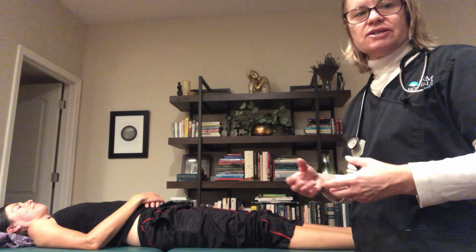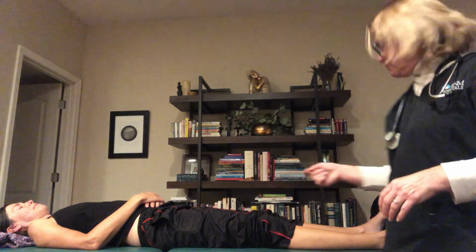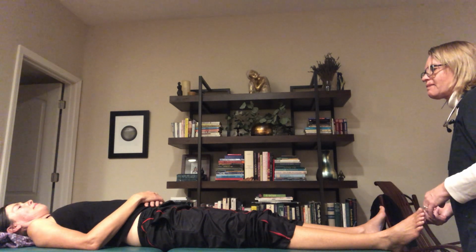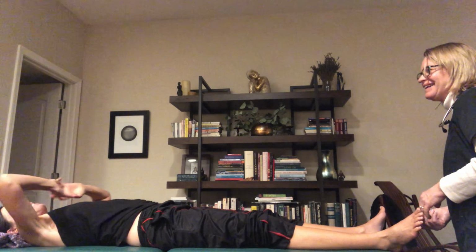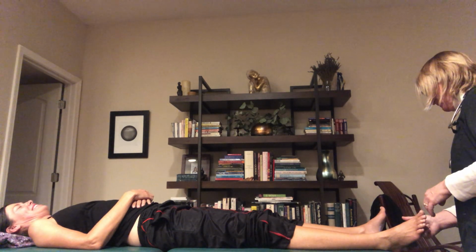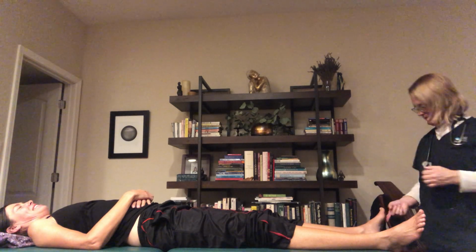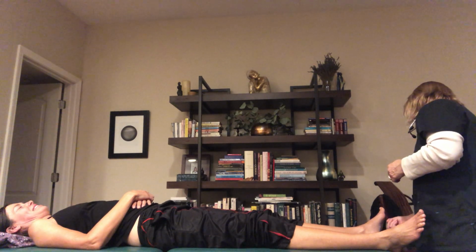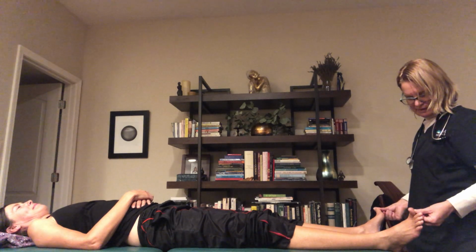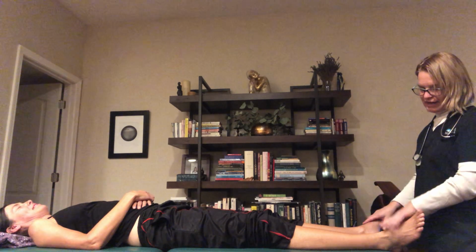After the inspection, I would be checking for sensation to make sure that her nerves are intact, and I could use a variety of devices for that. But I could ask her to pretend I've got this. Can you feel that? Yes. Just every time I'm pushing, let me know if you feel it. Yes. And any pain anywhere? No. Okay. She's feeling all that, and I would be checking that with her hands as well.